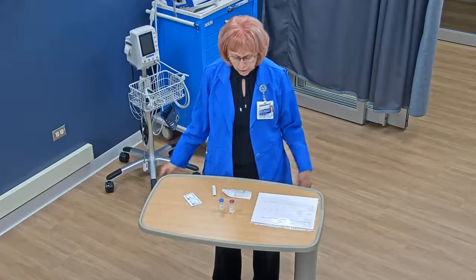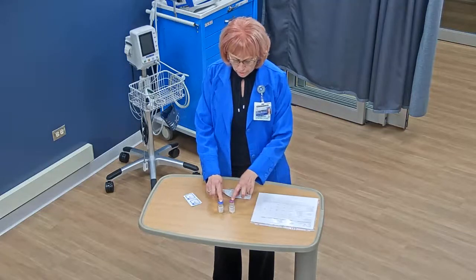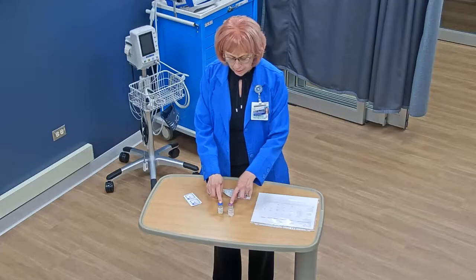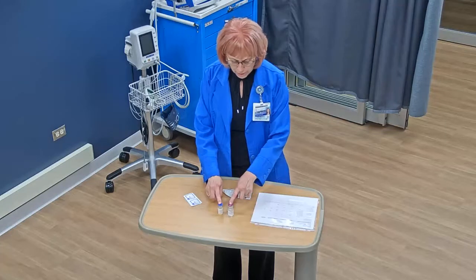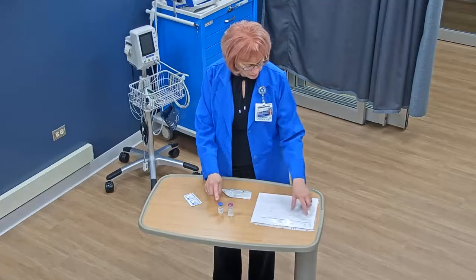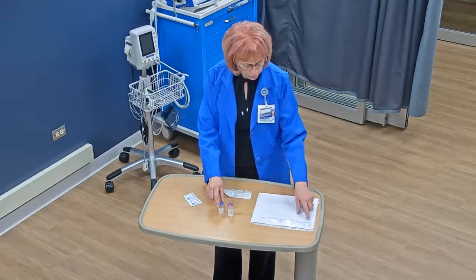First up for this procedure is to have your equipment. Here I have the medication — this is ceftriaxone. It is in a powder, and I have here the diluent, that's the liquid that is going to be put into the vial to reconstitute the powder. Over here I have my MAR that tells me I have ceftriaxone, and I can see it on my vial: ceftriaxone, 500 milligrams.